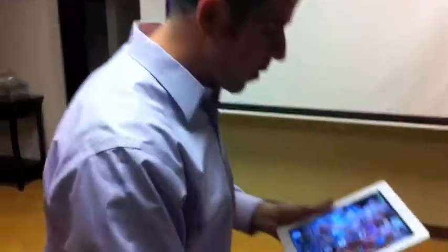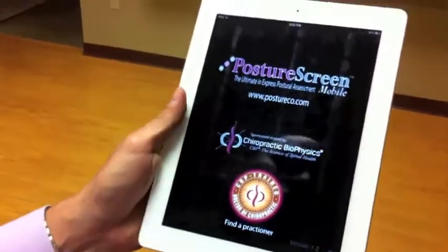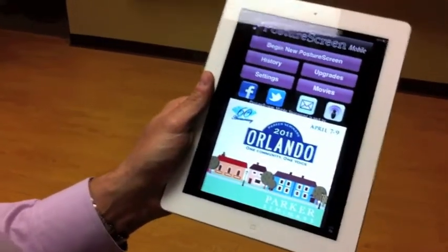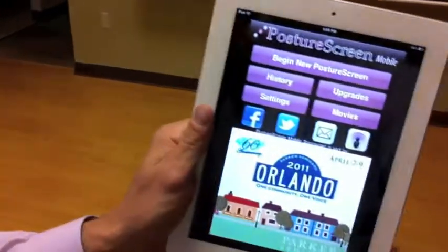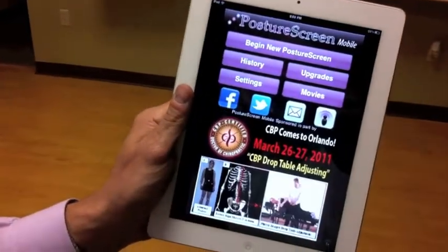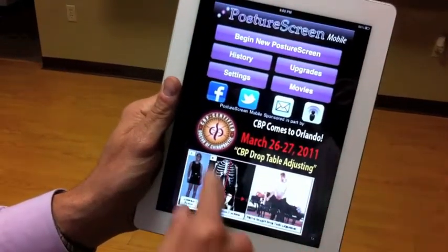What we're going to do is I'm going to give you a tour of some of the features — there are some really good features with this new updated app. So why don't you go ahead and come on a little closer here. We're going to start Posture Screen and do a screening. One of the reasons why this app is only 10 cents to use for an evaluation is simply because we actually have advertisers that will subsidize the cost of the app. So let's review some of the new features.